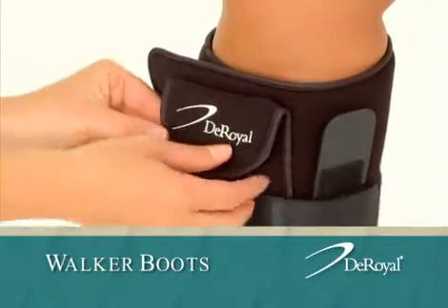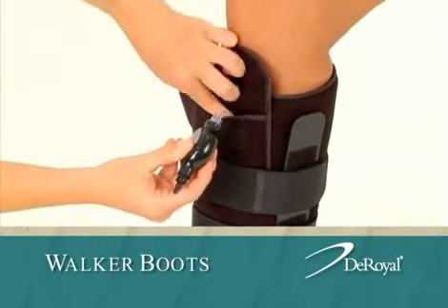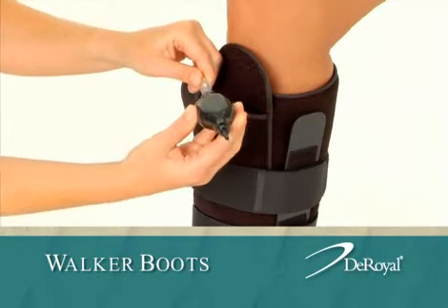To adjust the air pressure in the pneumatic wrap, open the pocket at the top of the wrap and remove the black bulb and air tube. To inflate, insert the clear end of the bulb into the tube and squeeze.